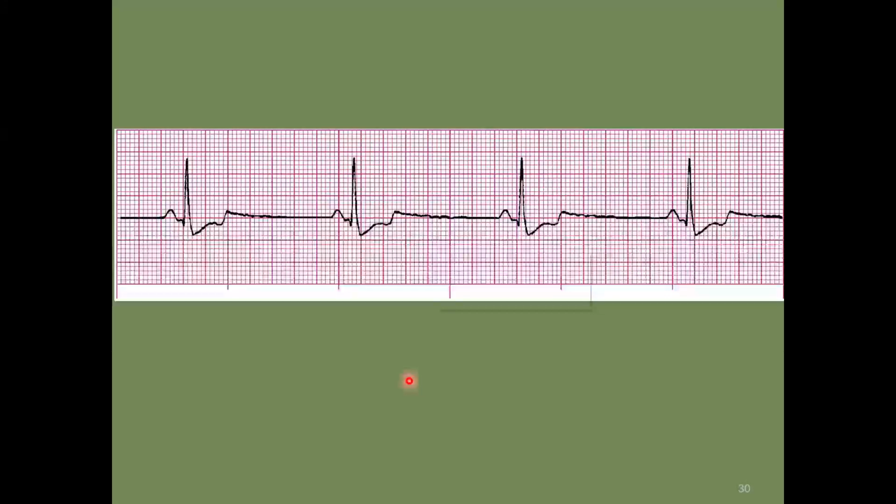All right, somebody said sinus, and then somebody else said bradycardia. So put them together: sinus bradycardia. You're correct. You've got your P wave here. It's upright. It looks normal. And this is in lead II. I'm sorry, I cut that off, so I apologize for not telling you what lead we're looking at. You've got a slow rhythm, and you want to know, is this an athlete? Are they slow at baseline? And then ask yourself, are they hemodynamically stable? Because we don't have to treat every slow sinus bradycardia, but we do want to know what's going on with the patient. You might see this in somebody that has vasovagals, for many reasons.